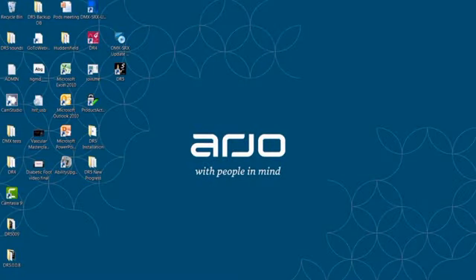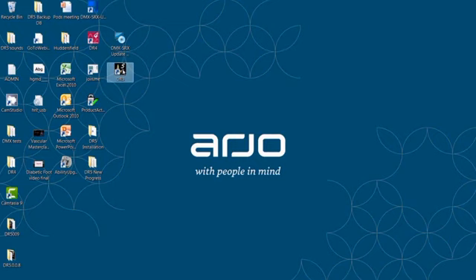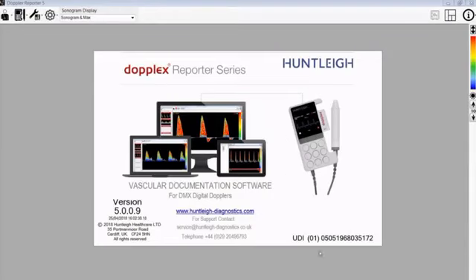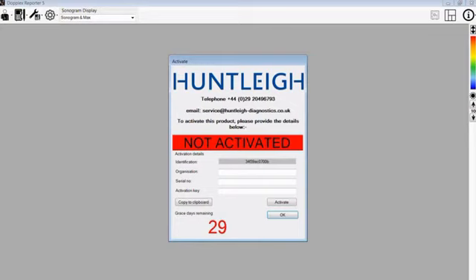Following successful installation of DR5 onto your PC, you will now have an icon on your desktop. To run the program, double click this icon and then the program will show the next window, which is for activation of the product.